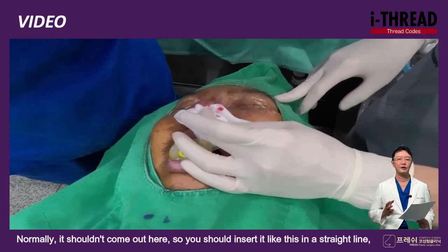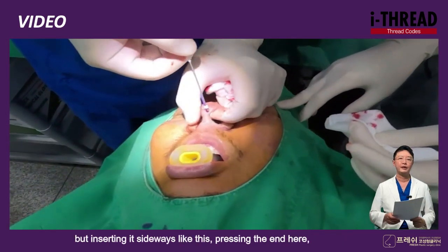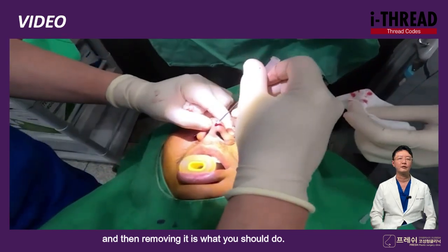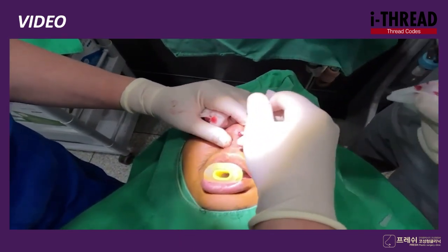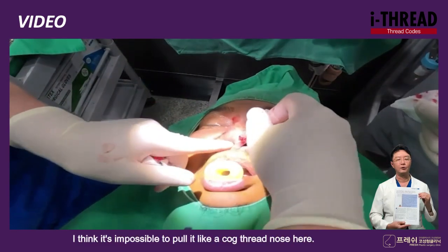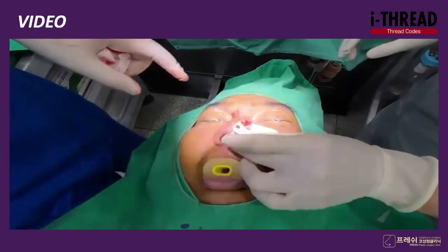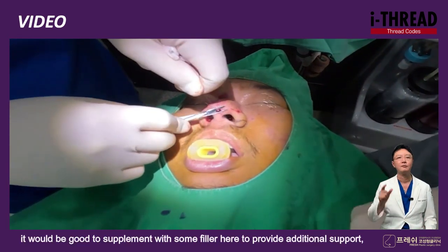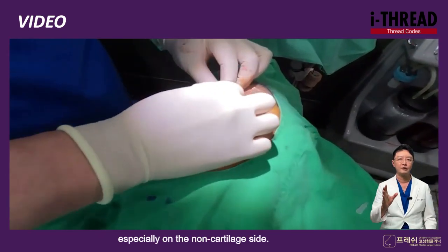Normally it shouldn't come out here, so you should insert it like this in a straight line, but inserting it sideways like this, pressing the end here, and then removing it is what you should do. I think it's impossible to pull it like a cog thread nose here. In my opinion, after doing this, it would be good to supplement with some filler here to provide additional support, especially on the non-cartilage side.